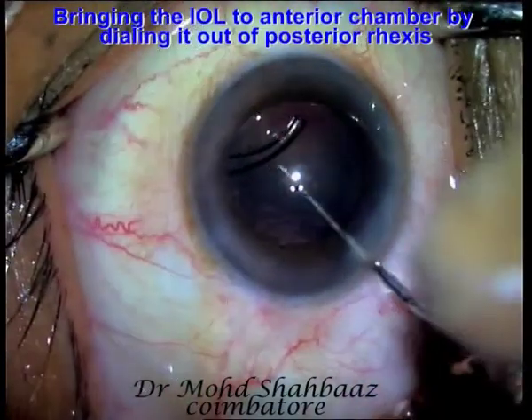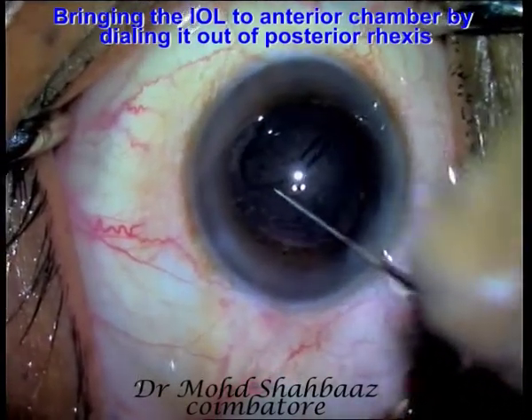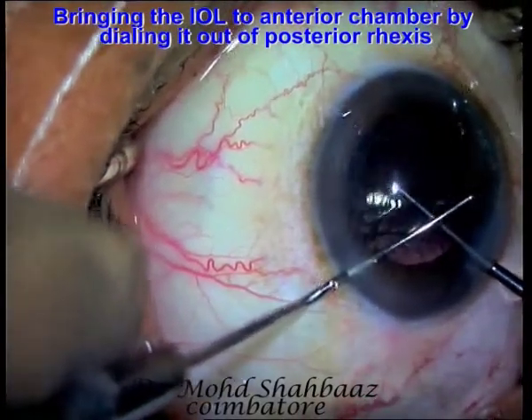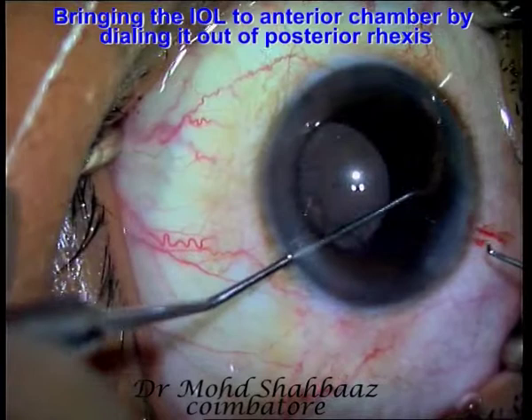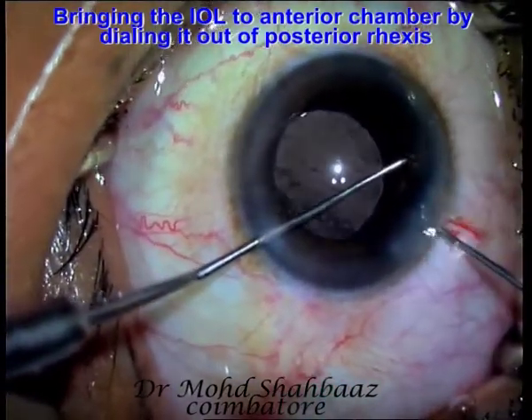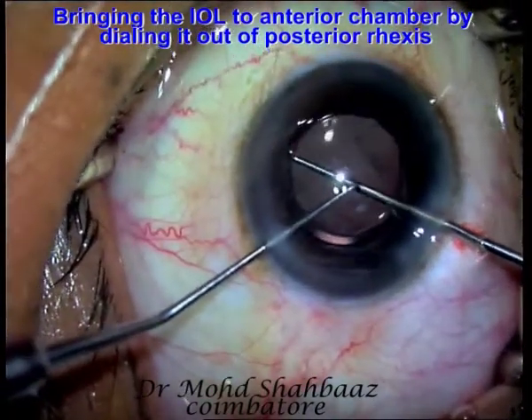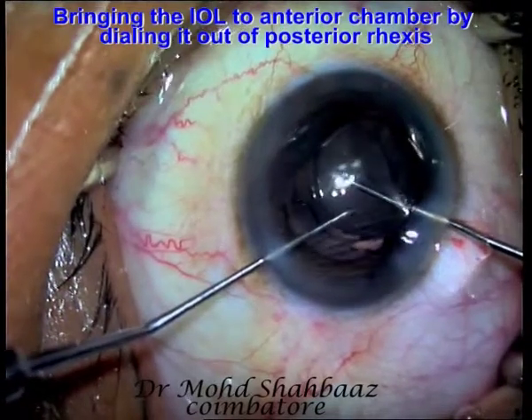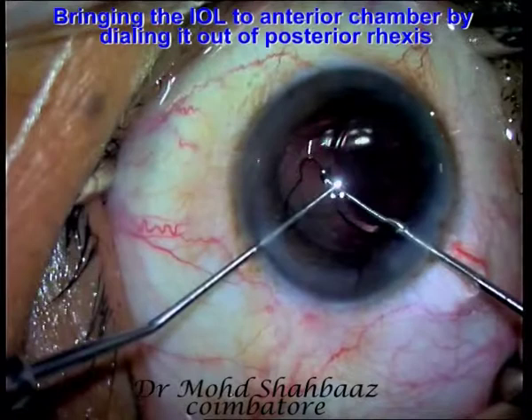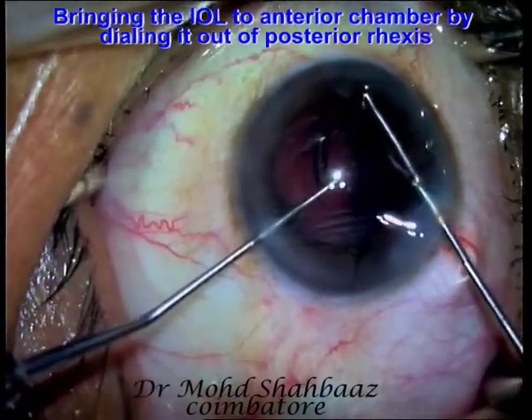So after doing the rhexis, the second big challenge was to remove the lens from the small rhexis. So I used two instruments and I tried to dial the lens out of the bag. I am using a reverse Sinskey hook to hold the lens from the posterior side and a Sinskey from the anterior side and dialing the lens outside the posterior capsulorhexis.